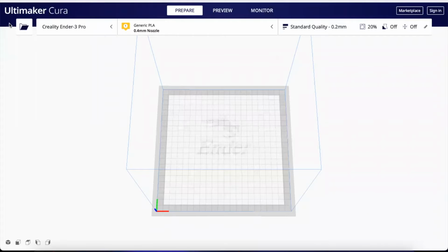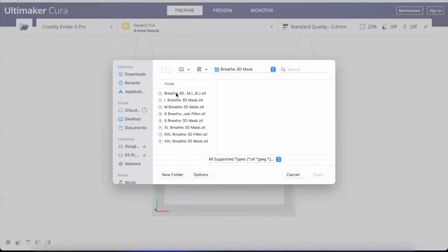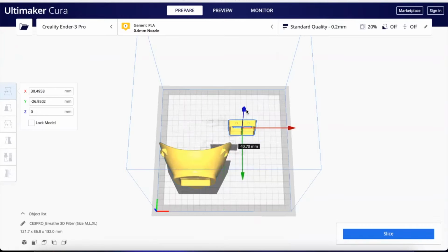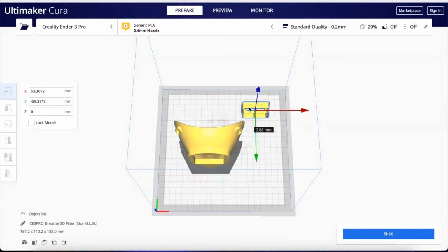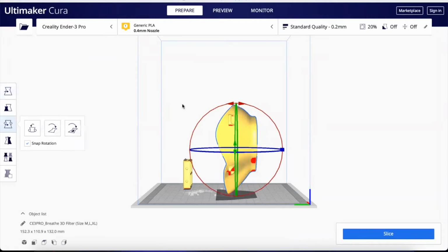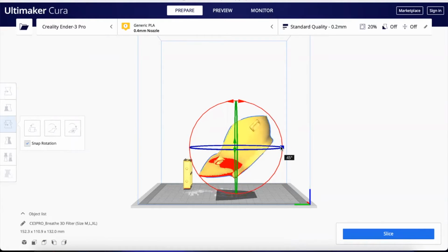Then, you're going to open Cura. Click on the folder on the top left corner. Select the mask files that you would like to print. If needed, rotate the mask on Cura to make sure the mask is flat on the bed.